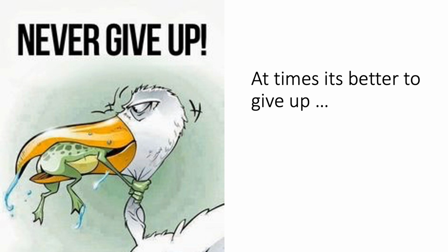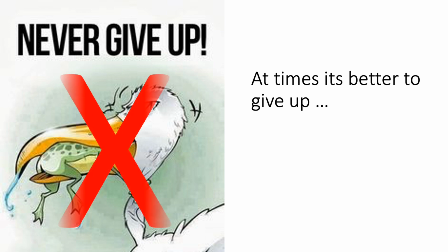And remember this very famous picture which says, never give up. But remember, especially when you're doing neurointervention, never be so stupid as not to give up. There is a time when you realize you're going through fatigue, things are not looking good, the catheters are not moving, the wires are not moving. Learn to give up.